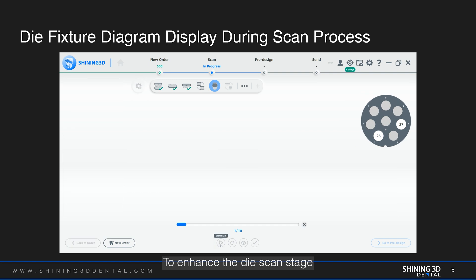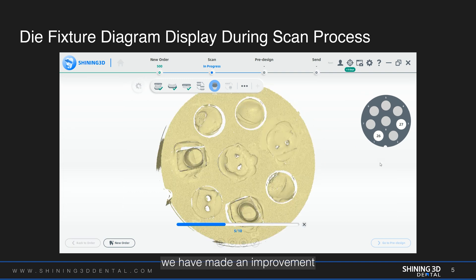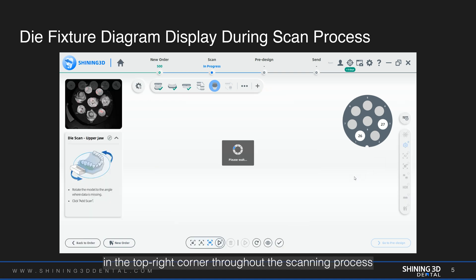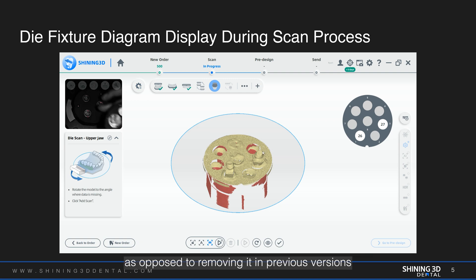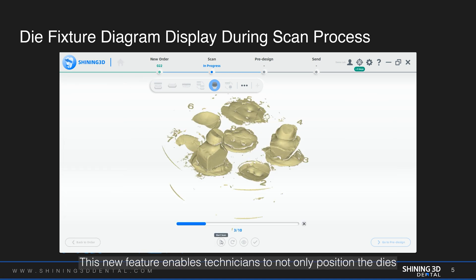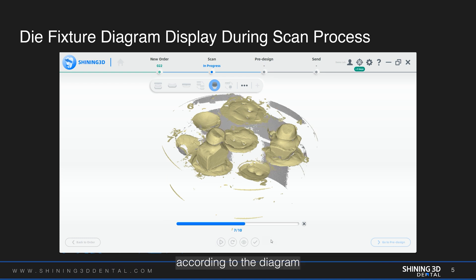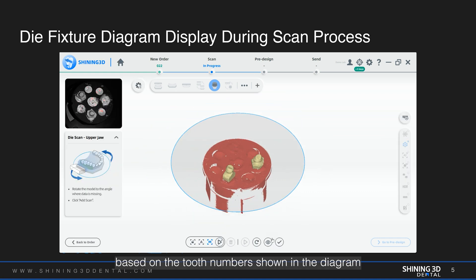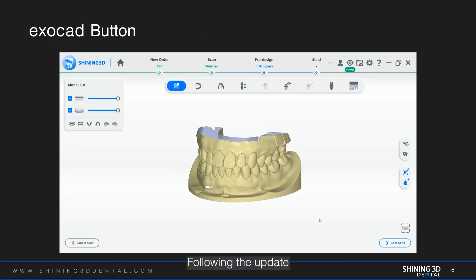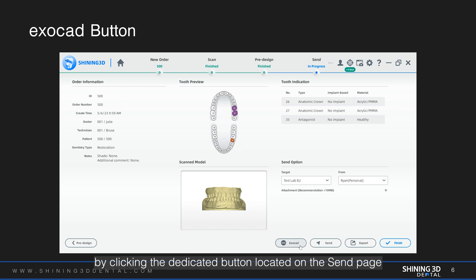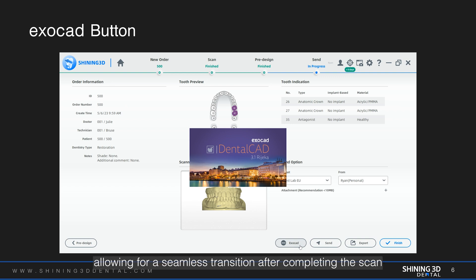To enhance the die scan stage, we have made an improvement to keep the die fixture diagram visible in the top right corner throughout the scanning process, as opposed to removing it in previous versions. This new feature enables technicians to not only position the dies according to the diagram, but also reattach them to the dental model based on the tooth numbers shown in the diagram. Following the update, you can easily access ExoCAD by clicking the dedicated button located on the send page, allowing for a seamless transition after completing the scan.